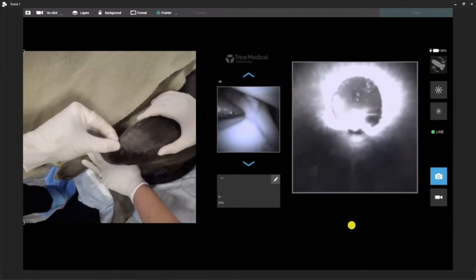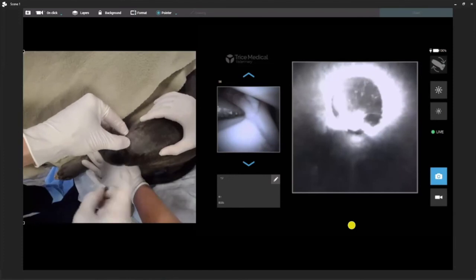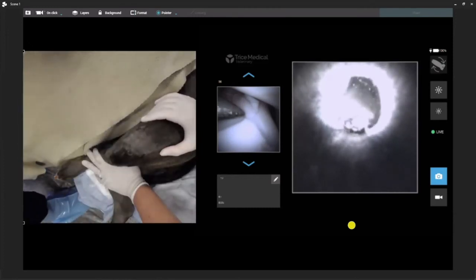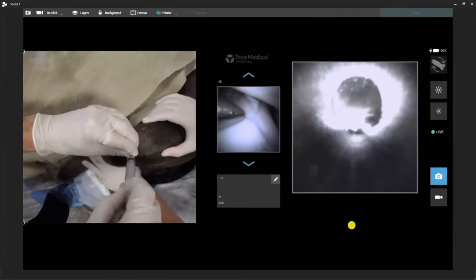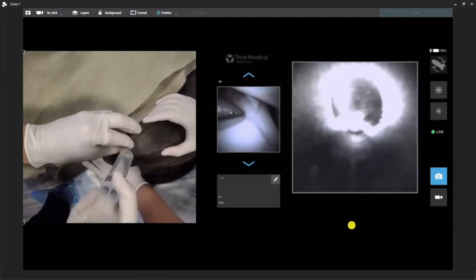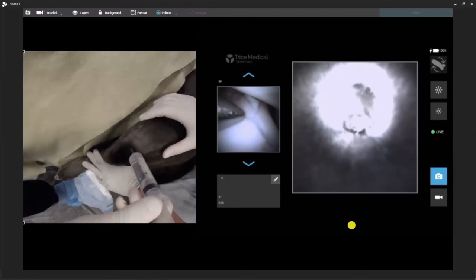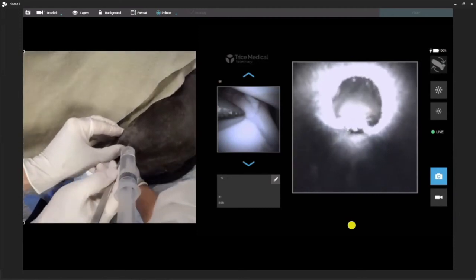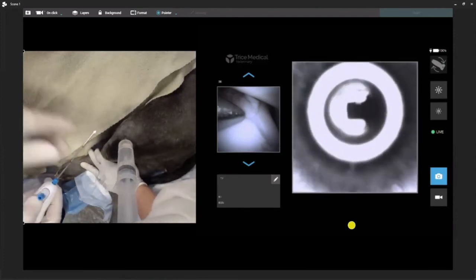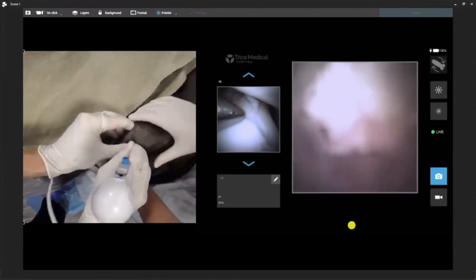I'm just going to go ahead and slide in just alongside. That area will be the lateral portal for the stifle. We'll aspirate next — and there we go. We'll go ahead and distend the joint. Now I'm going to enter the joint — it's likely going through the fat pad, of course, and that can be a challenge. Sometimes you're working through the fat pad, which can become a frustration for some doctors or veterinarians scoping knees. But there are many tricks to get around the fat pad. We'll make a little stab, making sure we have our optics retracted. Entering the stifle with the sheath first — we can see where our needle is, we're happy with the placement. One, two, three — slide out the needle, slide the scope all in.